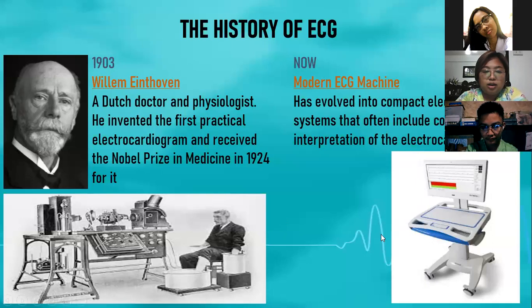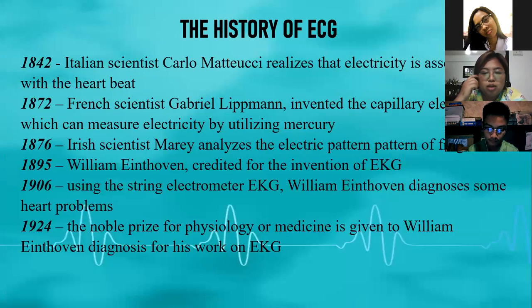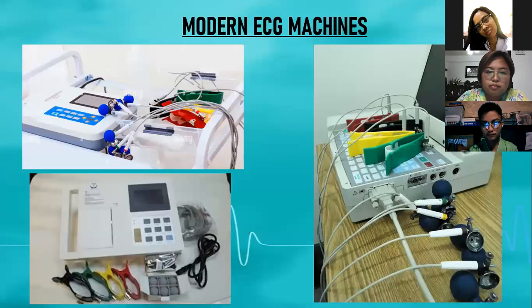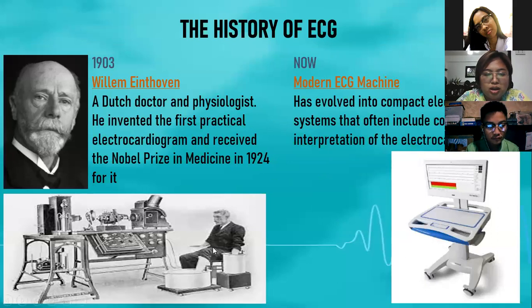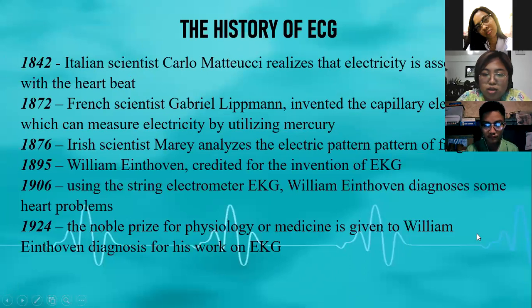So ito, mga history lang naman po ng ating ECG. Minsan kasi lumalabas to sa boards, pero ginagawa kasi to na bonus question, ganyan. So, ito na po ang ating modern ECG machines. Unlike nung first, tignan nyo yung first. Diba? Ang dami po niyang mga ginamit. Pero ngayon, tignan nyo, kahit hilahilain nyo, buhat-buhatin nyo, pwede na.